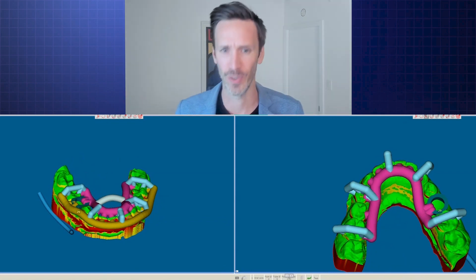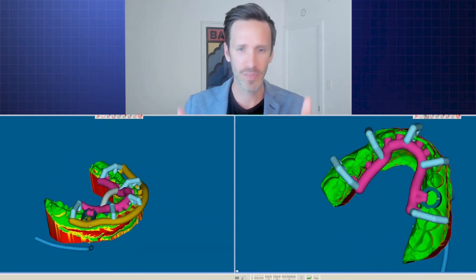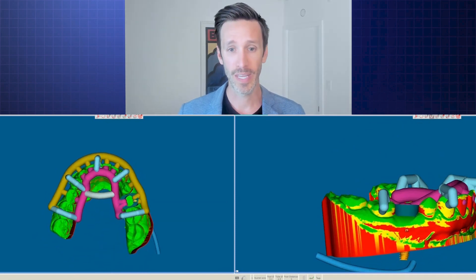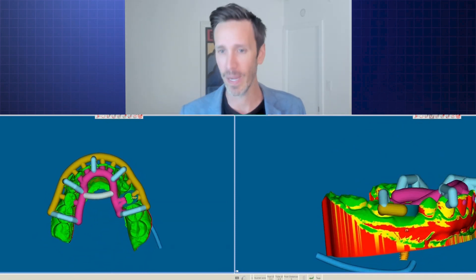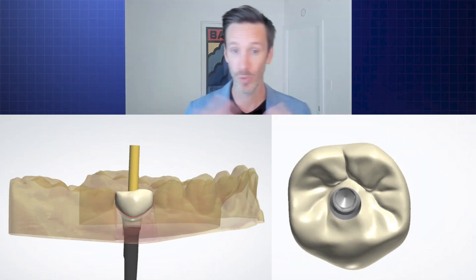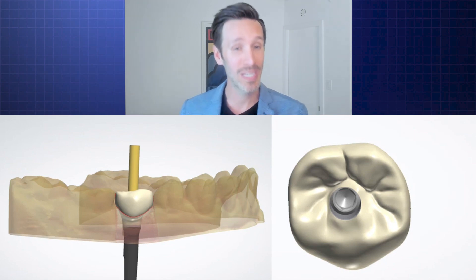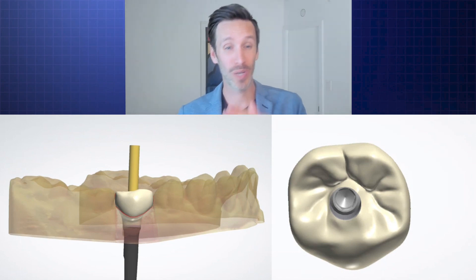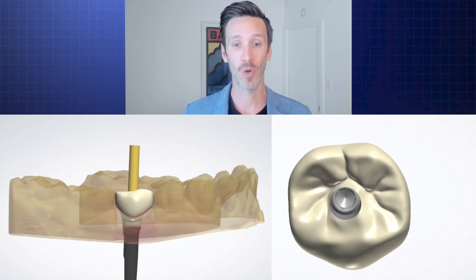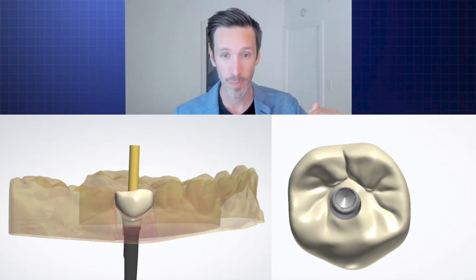That means my hand or my assistant's hand can retract, suction, or add water if needed. Having one extra hand is fairly useful in surgery. I can also see everything really well — I can see the other teeth. Speaking of irrigation, I can get better irrigation down into the area because it's not fully covered by a guide. Because we are doing this fully guided surgery, we attempted to pre-plan the provisional and we're going to do it on top of that connect abutment — a screw-retained provisional going on top of that stay-in abutment.